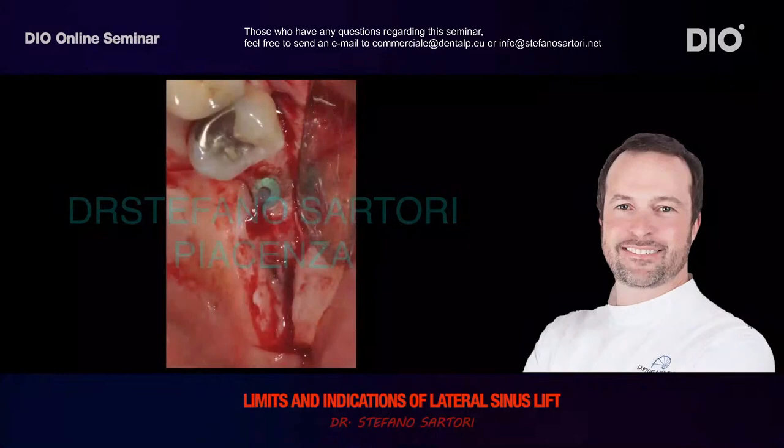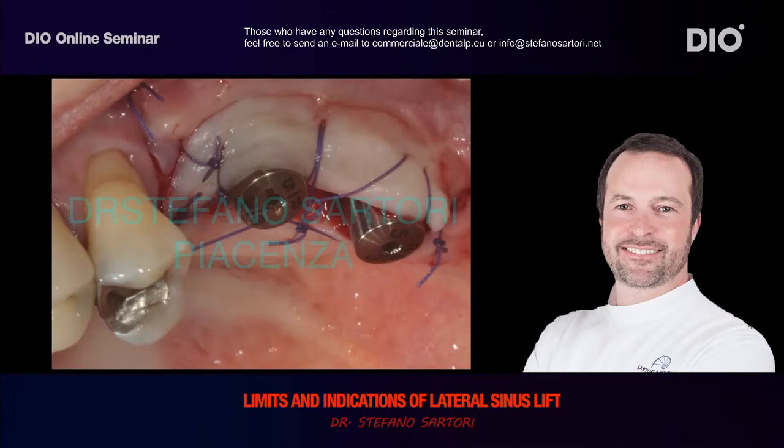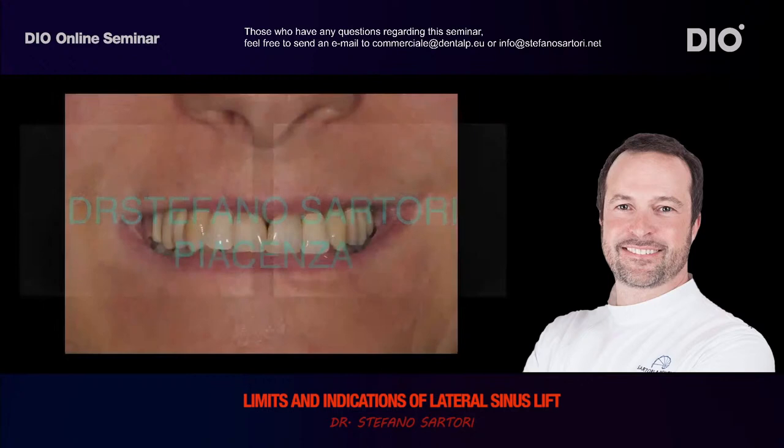Half thickness flap, buccal position of the keratinized palatal tissue, but look at the suture technique I have performed. I've performed a lot of mattress sutures to perfectly adapt the keratinized tissue to the buccal aspect of the healing abutments. The situation before the soft tissue management on the left, and on the right after soft tissue management. This is the finalized case, and this is the case with a control after 24 months. The prosthetic rehabilitation, and the occlusal view of the rehabilitation.